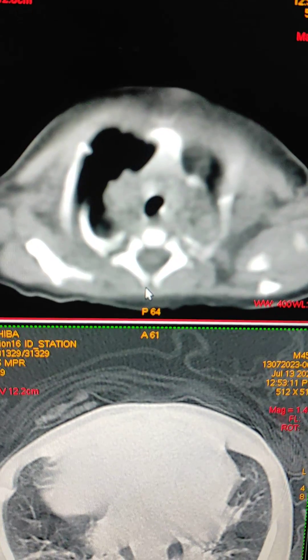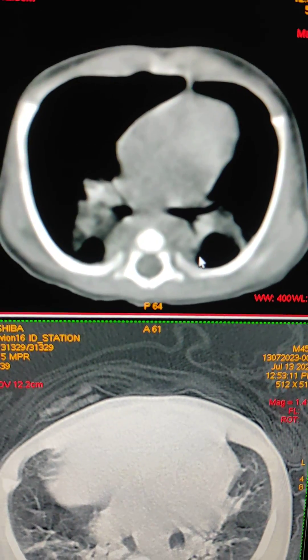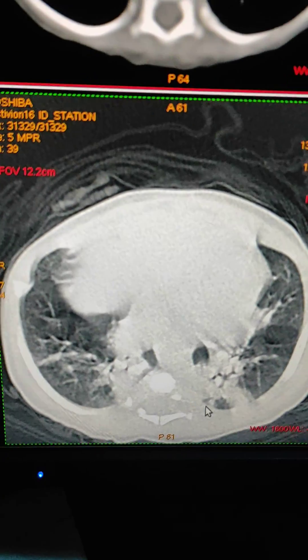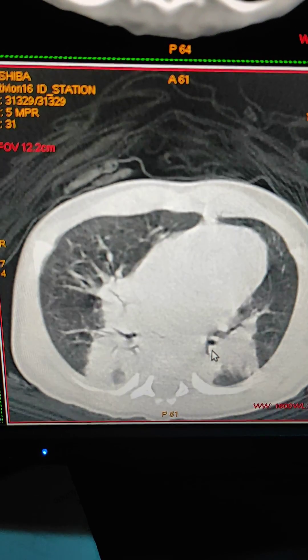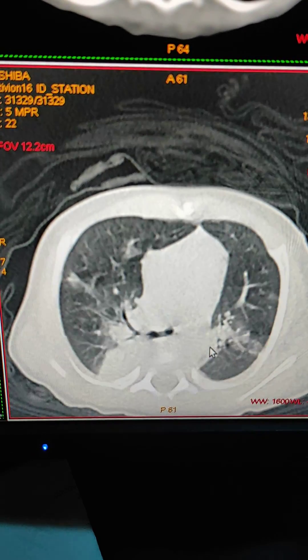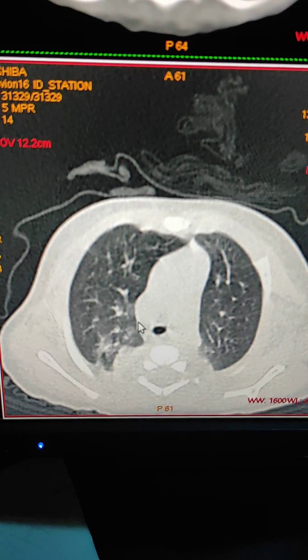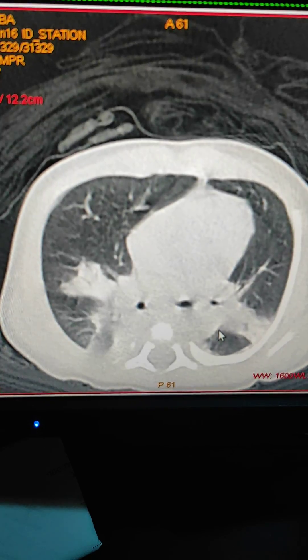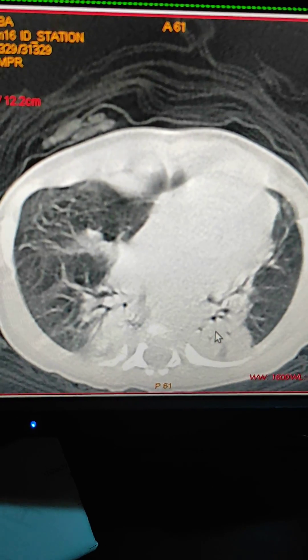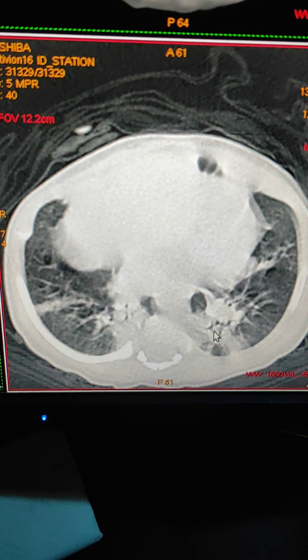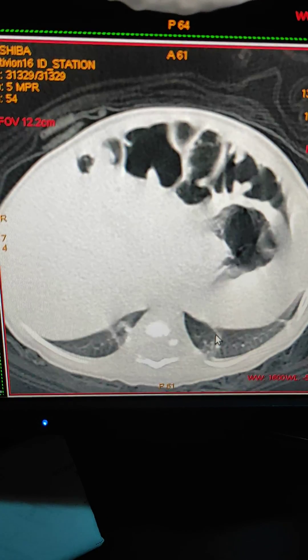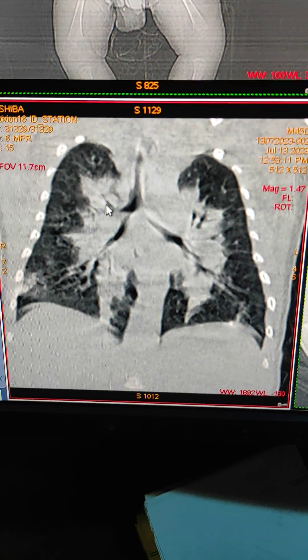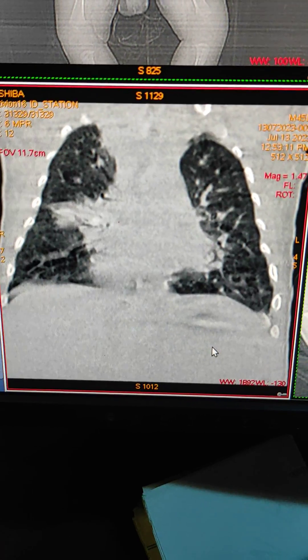The opacities are in both upper, middle, and lower lobes. This is the mediastinal window. Now I'll show you the lung window. You can see in both the lungs there are bilateral opacities. Mostly it's consolidation — mostly infective etiology. This is the coronal view. In bilateral lungs there are opacities, as you can see.